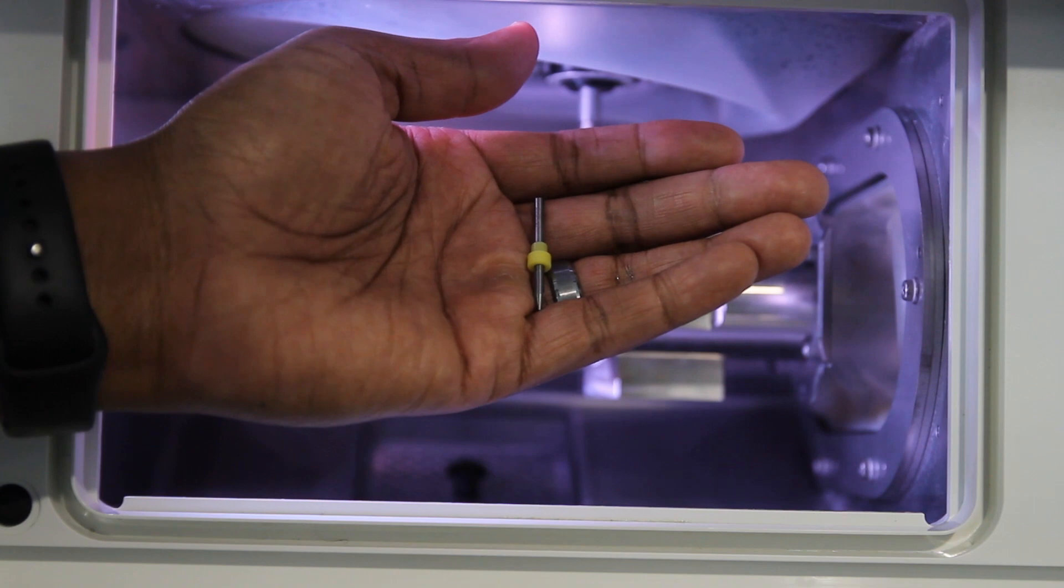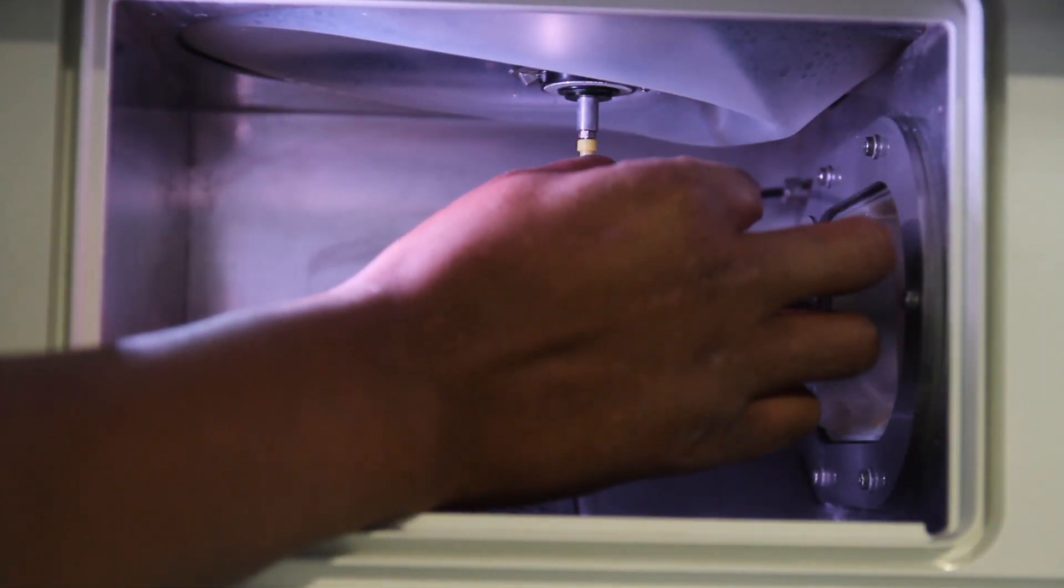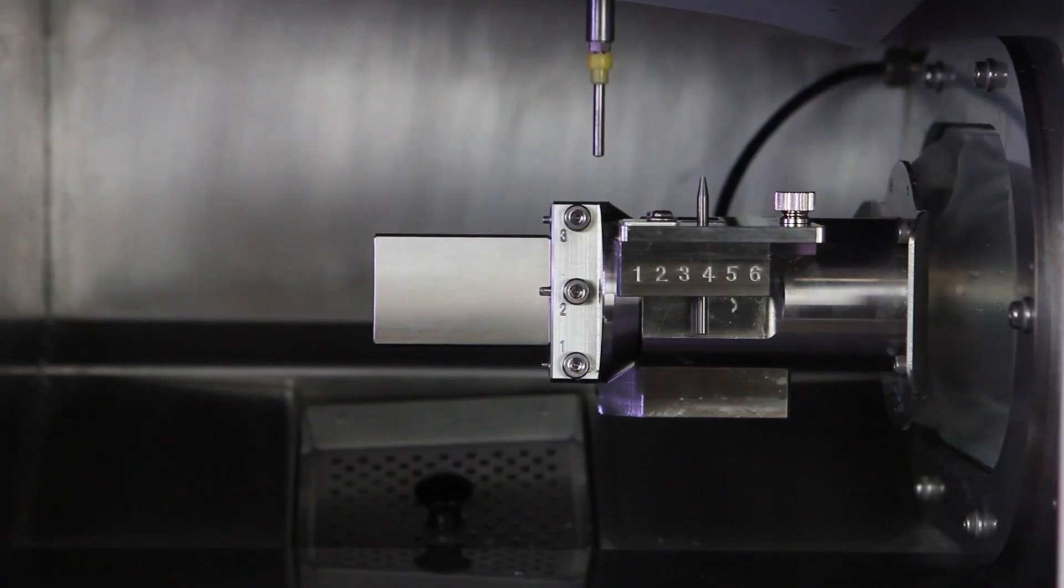Next, insert the detection pin into the open slot on the ATC magazine correction jig. Close the front cover.